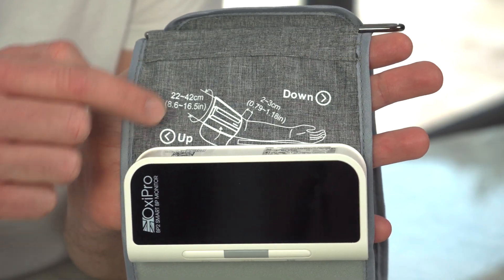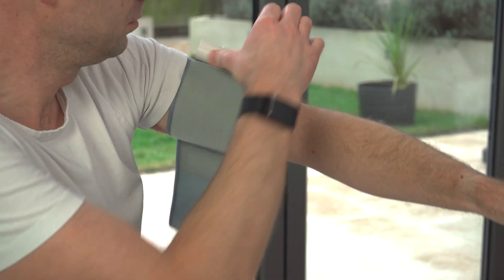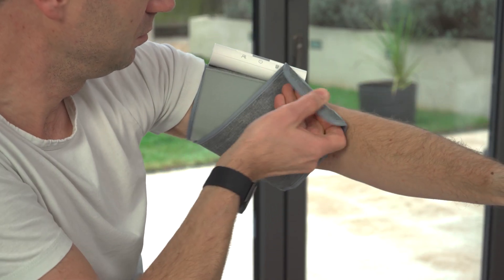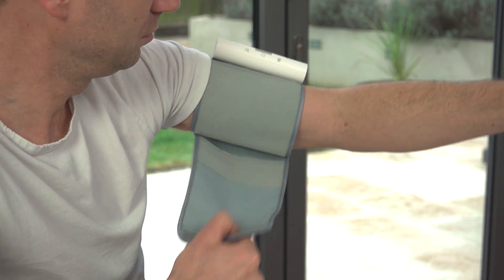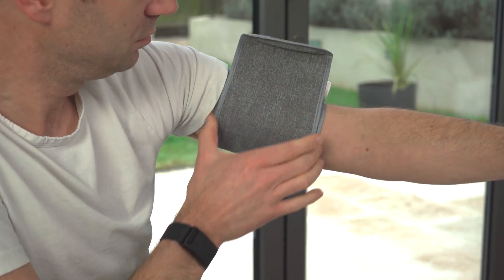Take note of the directional arrows on the cuff. The down arrow should be pointing down your arm when the cuff is being worn. When closing the cuff, it is important not to misalign the closing end. If it is offset, your readings may become inaccurate. Make sure the cuff is aligned correctly before taking a measurement.